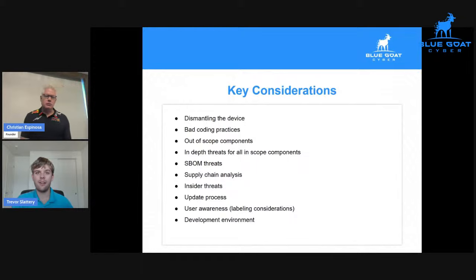The FDA specifically is looking for vulnerabilities in the CISA known exploited vulnerabilities list. These are vulnerabilities that are actively exploited in the wild and seen by threat actors to be common methods of breach into a system. This does not mean that these are the only threats that should be considered. Of course, any CVE that pops up in a component of the SBOM is a potential exploit. This does not mean that the exploit is public or necessarily well known, which will reduce the exploitability factor of the vulnerability, but it is still something important to consider.